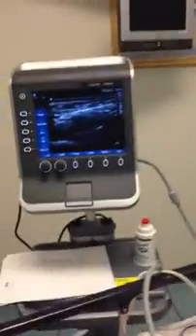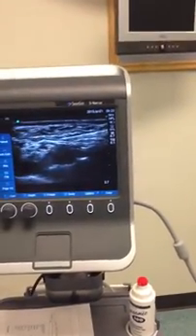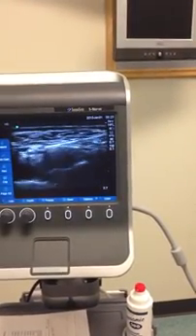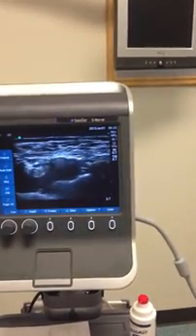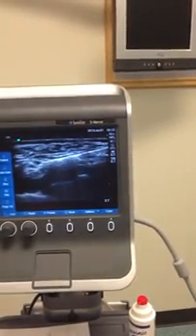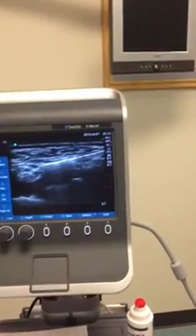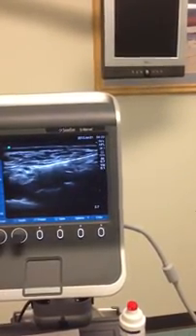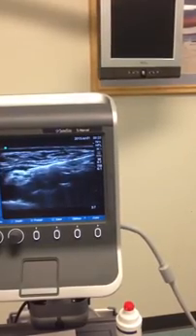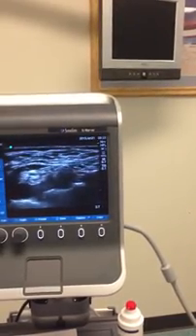You can see the needle on the screen very clearly. I'm just rubbing the plexus, going on top of the plexus, and now I'm right on top of the plexus. So without an assistant, I can just grab — I left the needle there. I'm going to start slowly injecting. You can see the medication spreading — it's going to spread on top of the plexus.